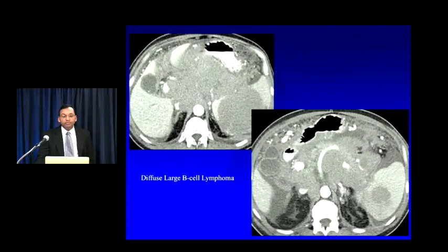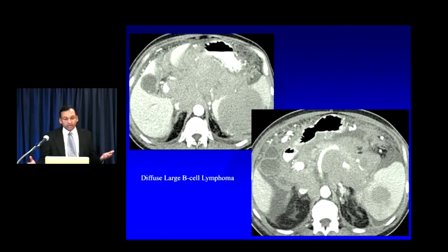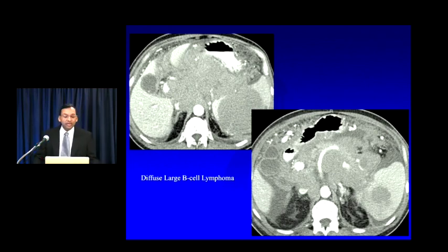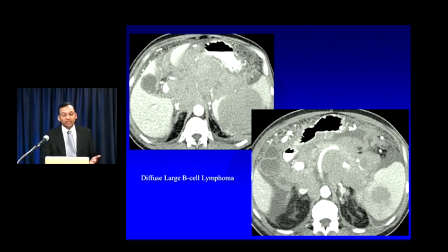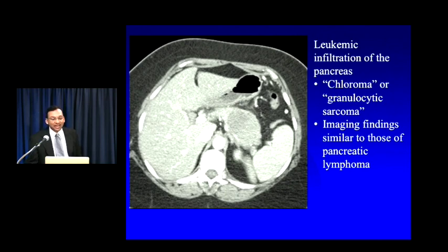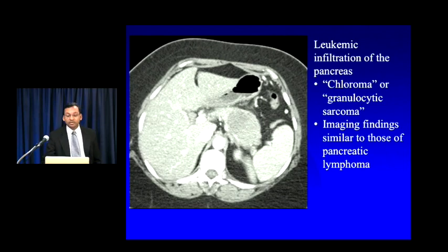Here's an example of a big mass surrounding the entire pancreas — easy to think it's pancreatic cancer, but it's involving multiple organs, encasing vessels with the SMA and splenic artery passing through completely unimpeded and unattenuated, massive lymphadenopathy, and a big splenic mass. This is diffuse large B-cell lymphoma. Leukemia in its focal form — so-called chloroma or granulocytic sarcoma — can look identical to lymphoma, and can rarely cause leukemic infiltration of the pancreas. Here's an example of a big hypodense mass in the pancreatic body-tail that turned out to be a chloroma.